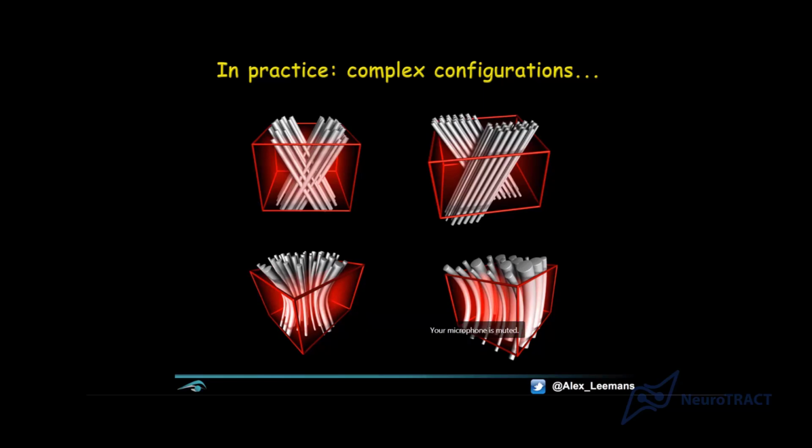But what about the left bottom? This type of configuration, what's the orientation? It should be clear now that we would be looking at an entire distribution of different orientations. And on average, that orientation is going up, down maybe. But that's only a very small fraction of pathways that is actually oriented like that. So you can already see the complications, right? If the information provided by the model does not capture the complexity of the underlying tissue, then we need to resort to other models.